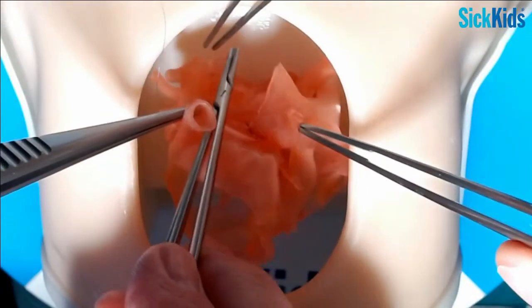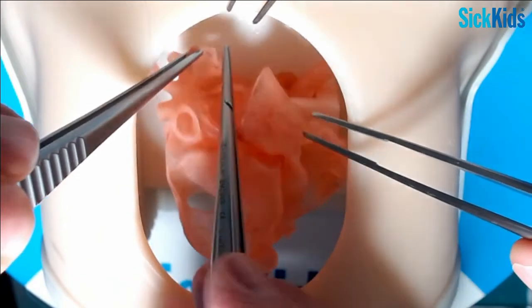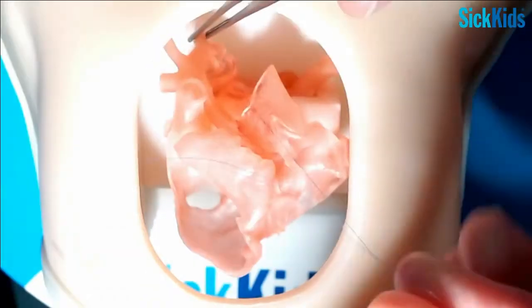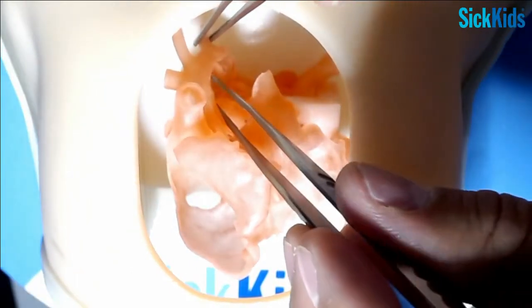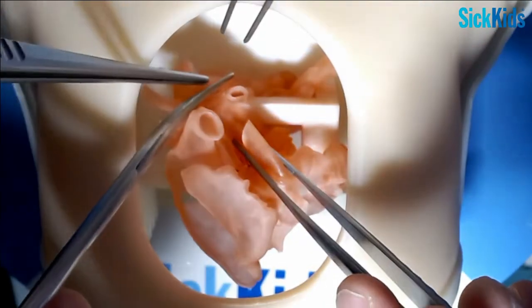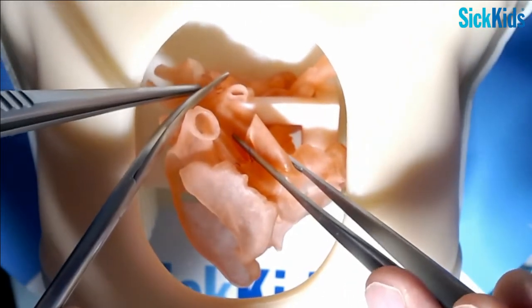Let's put one more over here. This is all run. I'm just doing a few interrupted so you don't have to watch me sew everything, and we'll get through this a little faster. Okay, cut that. Okay, so now you need to make one more incision, which is your counterincision for the interdigitating anastomosis. The interdigitating anastomosis is going to add 10 or 15 minutes to your case, but you get rid of the recurrent coarctation. So the back wall's done.